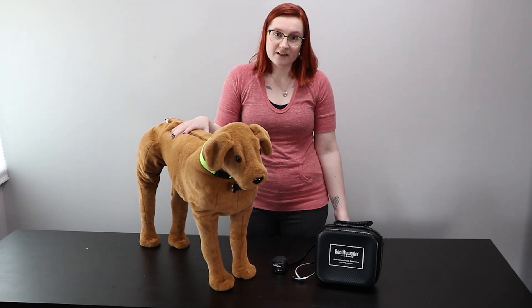And there you have it — easy as that. Contact us today for more information about our canine auscultation trainer or any of our other hands-on teaching tools.